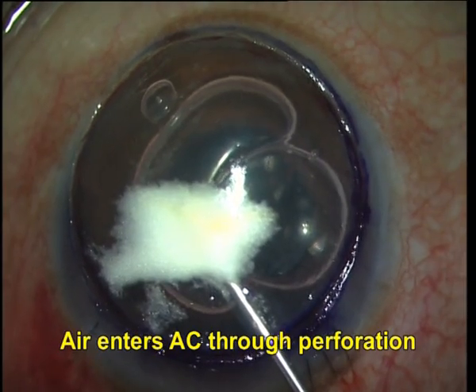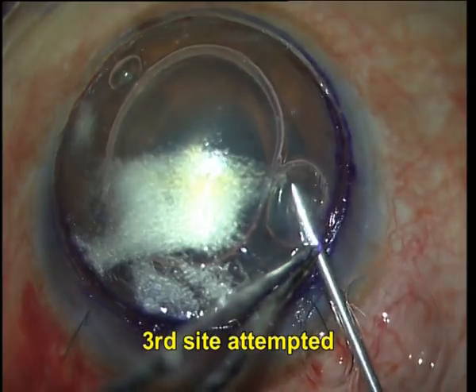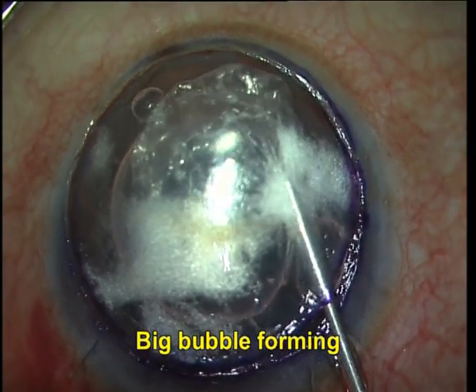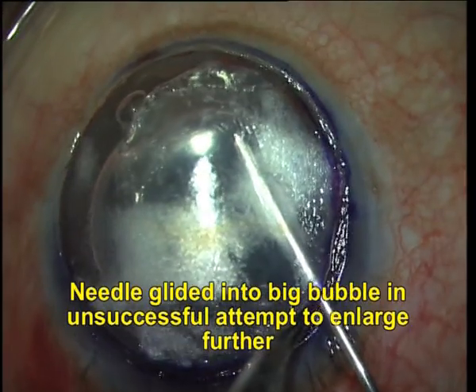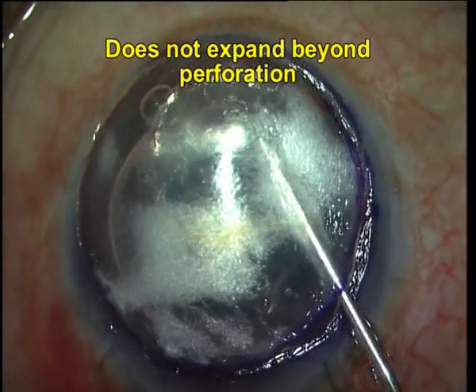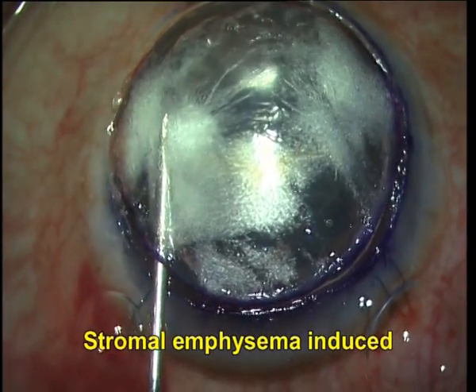I am trying a second pass and you can see that air is entering the anterior chamber through the perforation and all I get is some tissue emphysema. A third side is attempted and you can see a big bubble forming now. It's not really enlarging beyond the point of perforation. I have glided my needle into the big bubble in an attempt to enlarge it further, but again, it refuses to enlarge beyond the point of perforation superiorly.